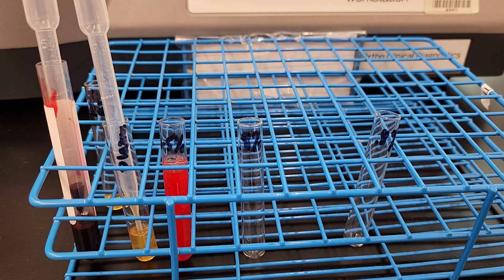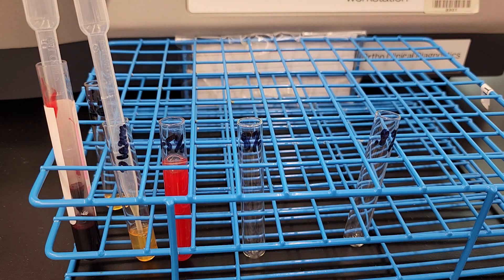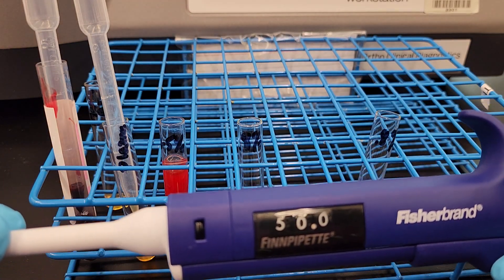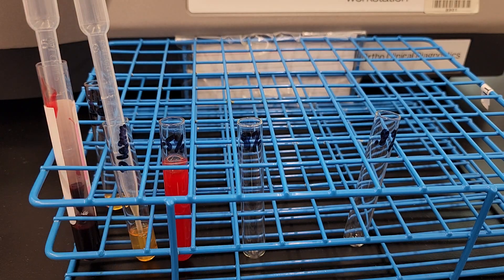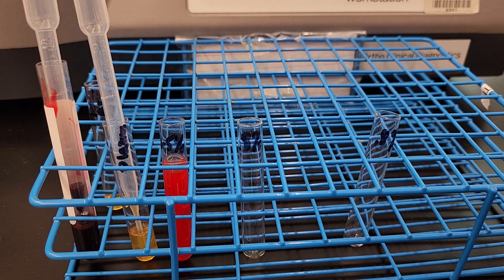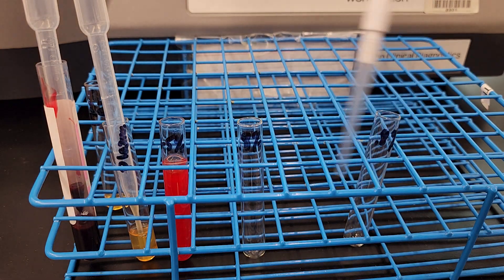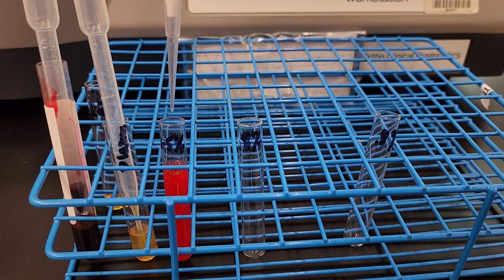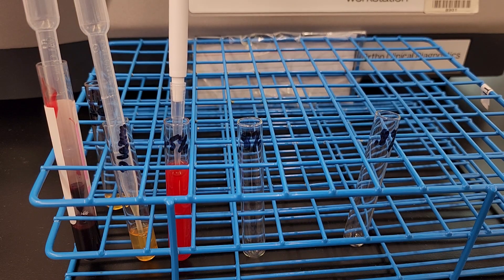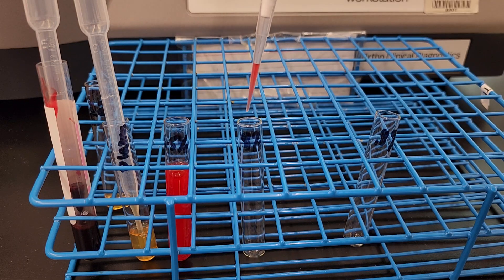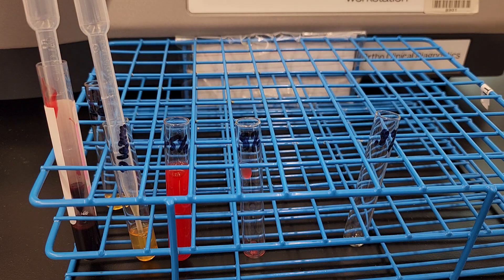So we want to just make sure to resuspend this real quick. And I'm going to prepare my pipette. So what I'm going to do is take 50 microliters of the 3 to 5% cell suspension, and I'm going to put it in here and then put 150 microliters into there of saline. So normal blood bank saline. So I got my tip on there. I'm pushing it down and putting it into the tube, making sure the tip's all the way in the tube before releasing and pulling up. So you can charge the pipette tip here. And now I'm going to dispense it into the 0.8%. You're going to notice that's not a lot. It's a micro amount, right?